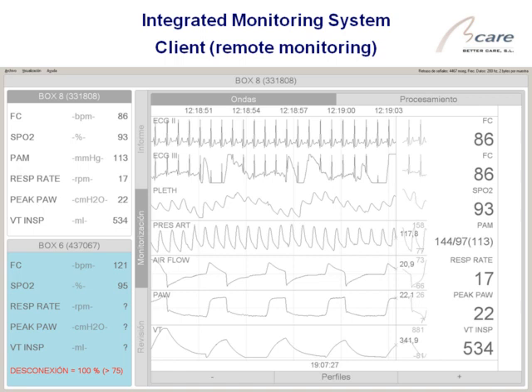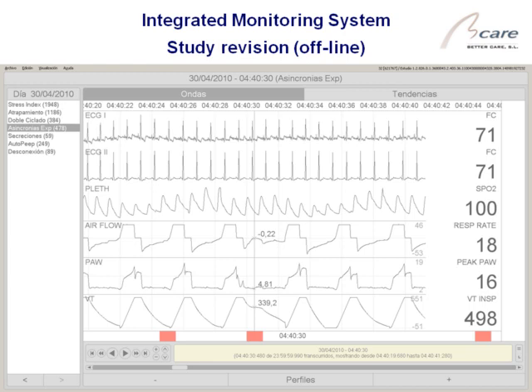Also, here you will see that each time, in that case, what's that? Asynchrony. I also have this asynchrony here. I'm sure that you know, but this is different from here, but the system analyzes this automatically.